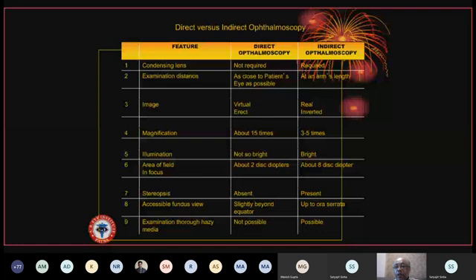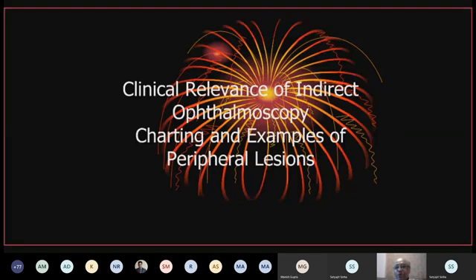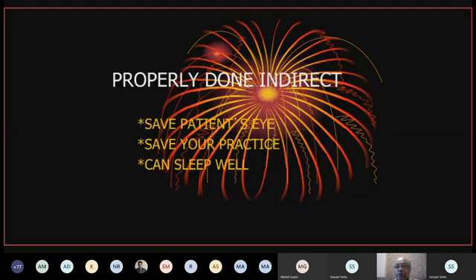If it's a thick, large membrane, the vessels will be pulled towards the fovea. These are hints that there is a membrane over there. And I would say in today's day, most of us would do an OCT if you have even the slightest doubt of the fovea not being clear. And you compare the other eye, you see both eyes are a little different.